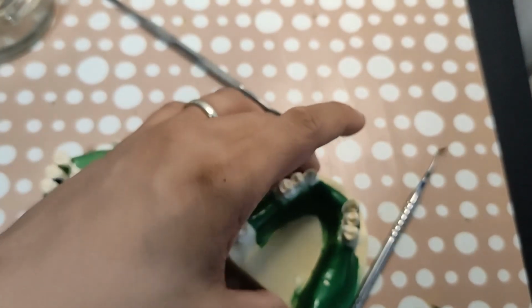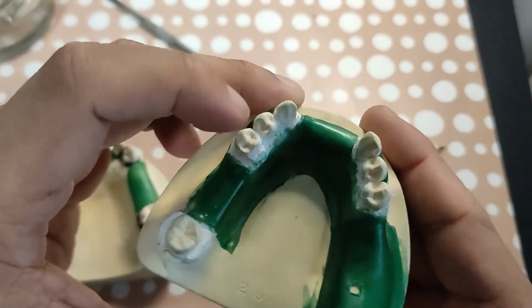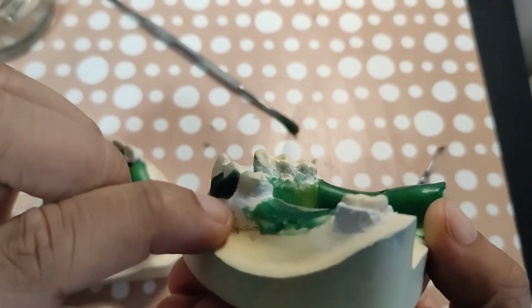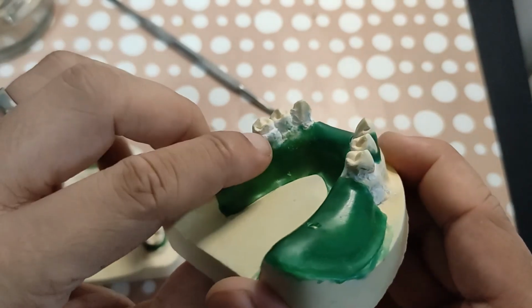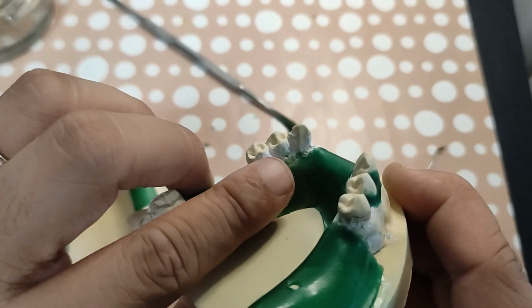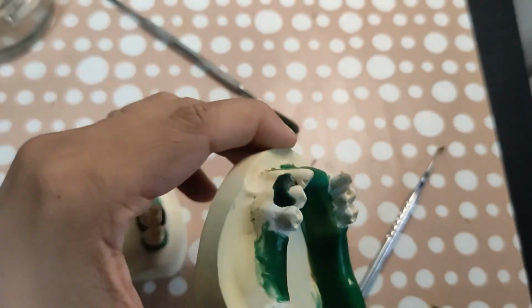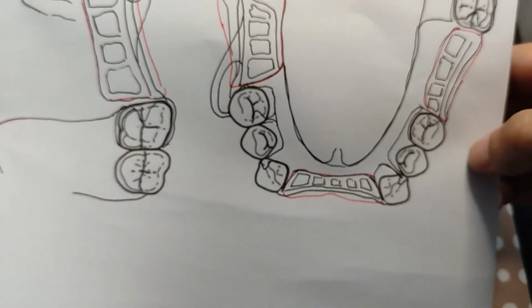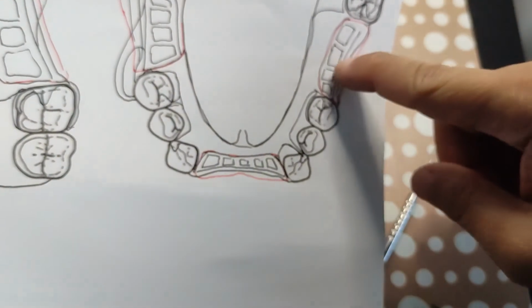So for example, for this one, for this premolar, I've decided to use an I-bar to cross gingivally here, but the lingual has a reciprocal arm, so that's why the shape blockout is only on the lingual, right? So you check your designs before you go on taking an impression. Okay, right? Oh, I forgot to place an I-bar here, but anyway, get an idea.